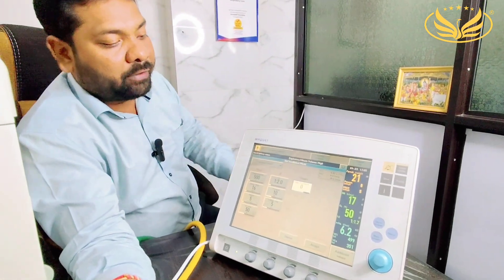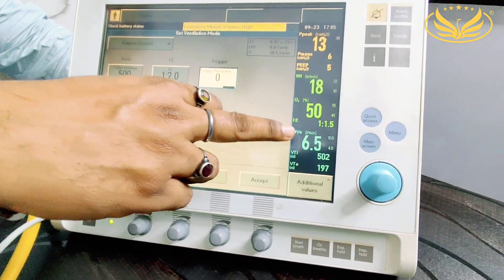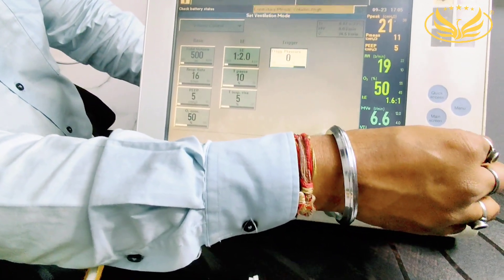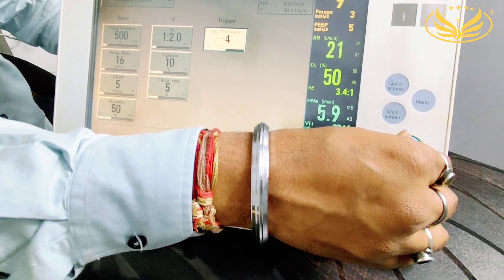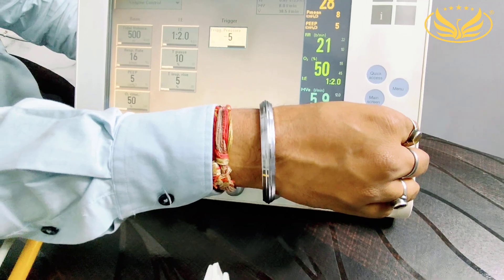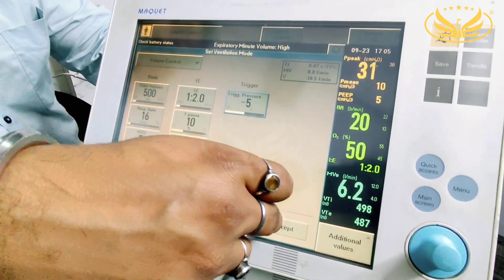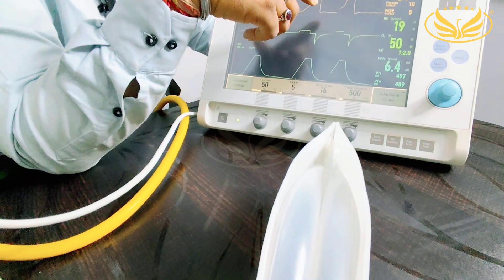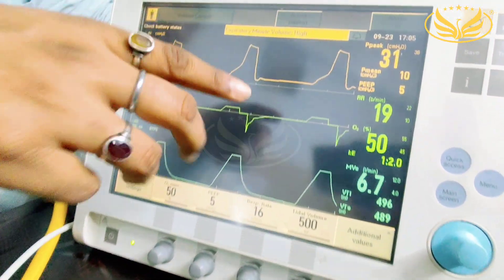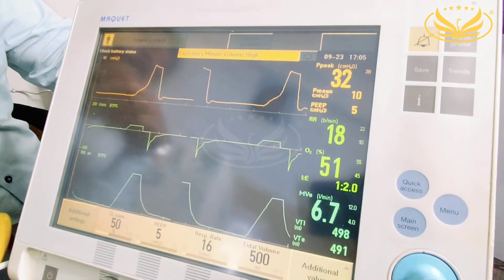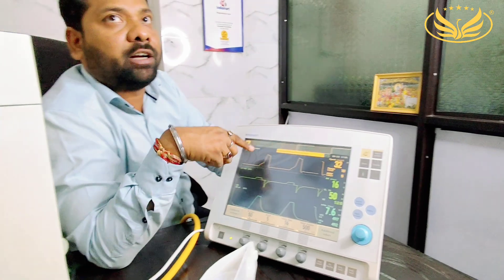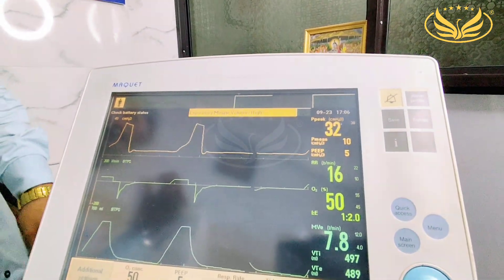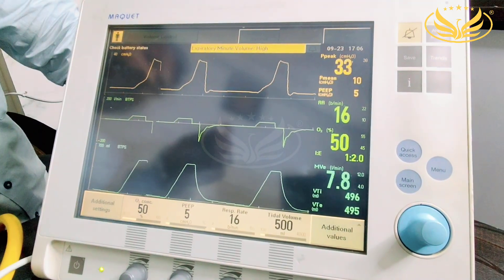From here, trigger. We have kept the trigger at zero, so false triggering will not happen. We have made sure that whatever trigger we have set — this trigger is basically the response of the patient asking for an extra breath. Because we have kept trigger sensitivity on, all the parameters are going properly, exactly as we have set them.